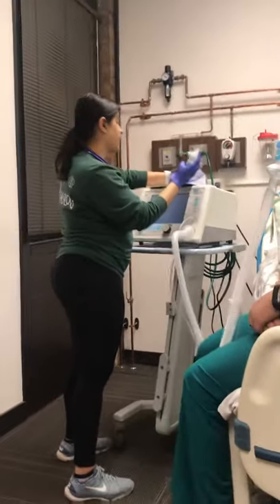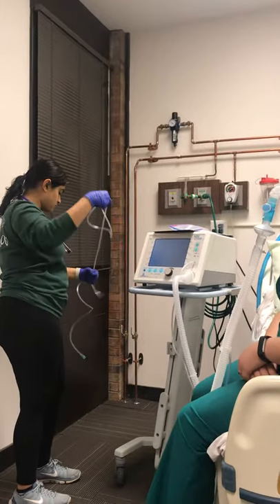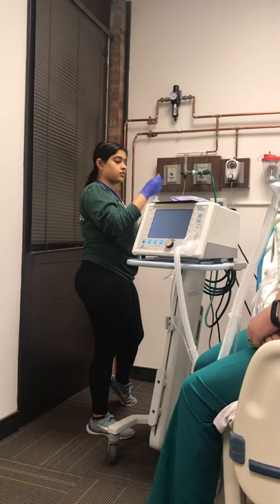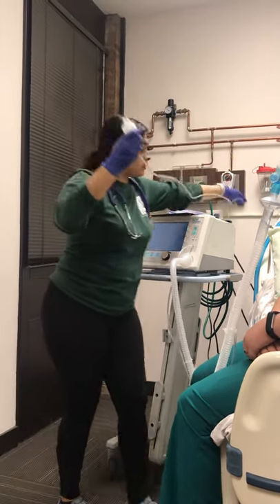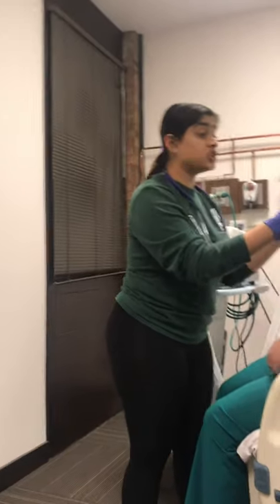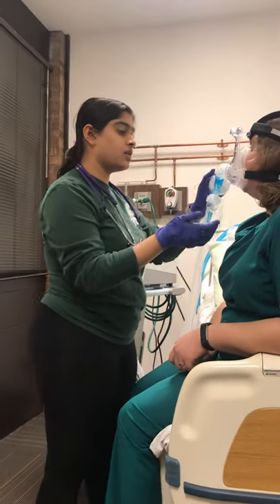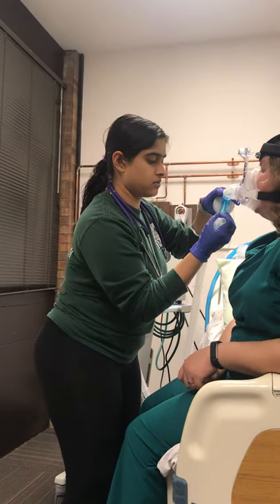So now we're going to start your nebulizer treatment. We're going to do this for 10 minutes. So we're going to let her run for 10 minutes, and then we're just going to jump ahead a little bit. So that looks like you're all done. I'm going to take the nebulizer off.